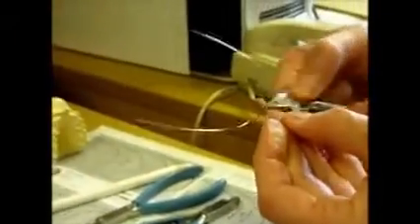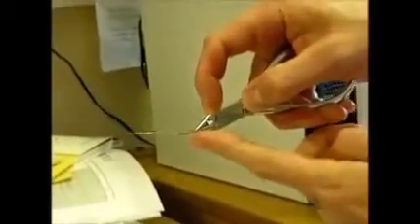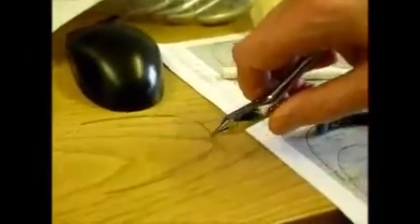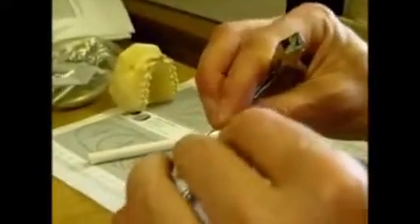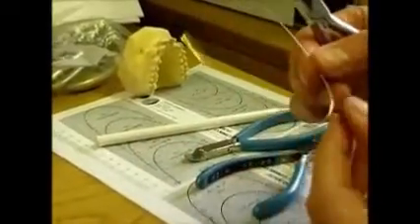Now the other little trick is that the amount of torque that you want in the labial segment is usually about the amount that's on the bevel of a plier. That would give you about your 15 degrees, so if you held the wire flat on the table here, then these arms should be parallel. If you had too much, it would be up, and if you didn't have enough, it would be down. And 15 degrees is usually what you need clinically, 15 to 20 degrees, or 10 to 20 degrees is probably a reasonable amount to put in to actually have an effect.